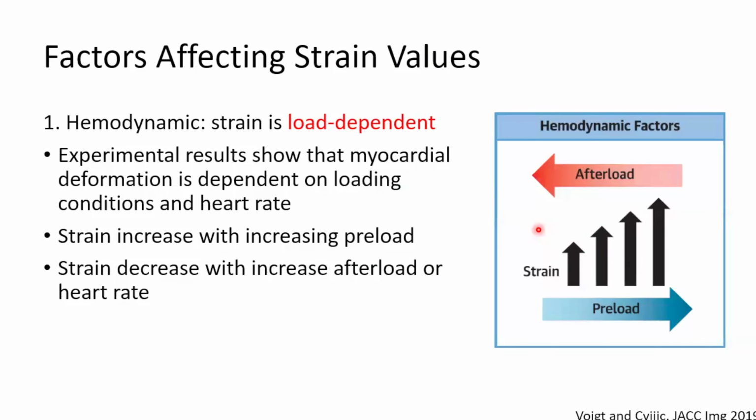So in the last few minutes, I know I'm running out of time just because we started a little bit late, I wanted to briefly touch on some of the factors that actually affect strain value and how that applies in clinical conditions. First of all, it's important to debunk the myth that strain is load independent, because it's not. It is load dependent.